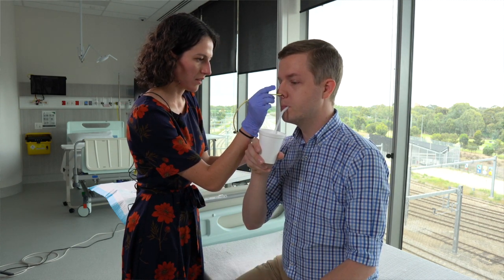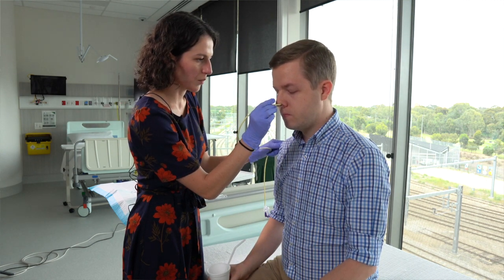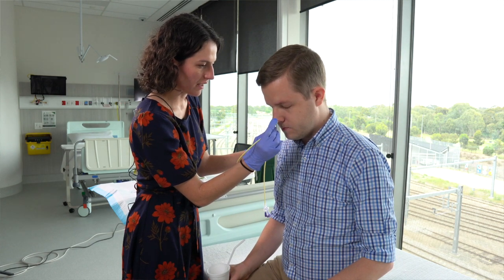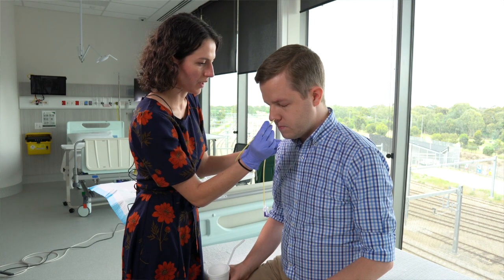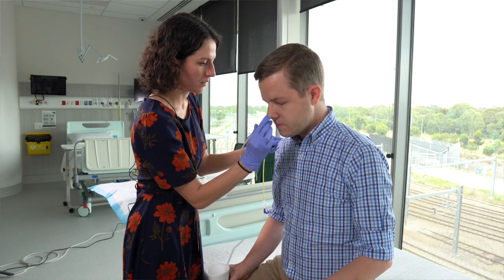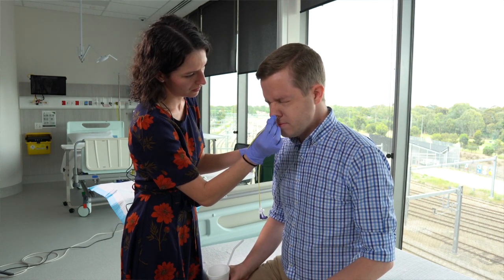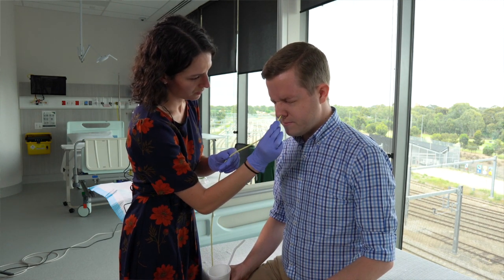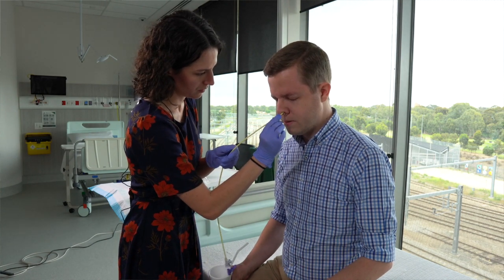At this point, get the patient to hold the water in their mouth and tip their chin downwards. Using a count of three and the cue to swallow, time rapid progression of the tube into the esophagus until the target length is reached. It's important to note that this must not be forcibly advanced, otherwise damage can occur. If the target length is not reached, it's unlikely to have reached the stomach and the tube should be removed and the attempt repeated.